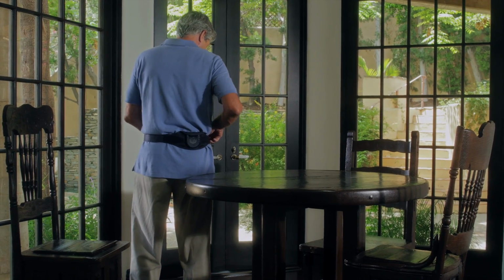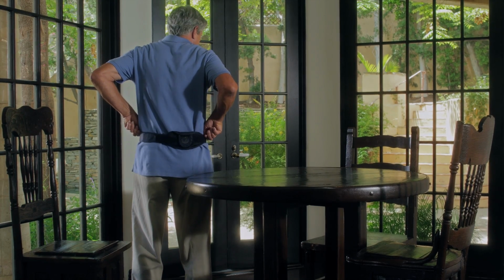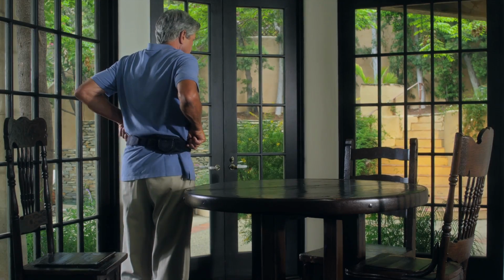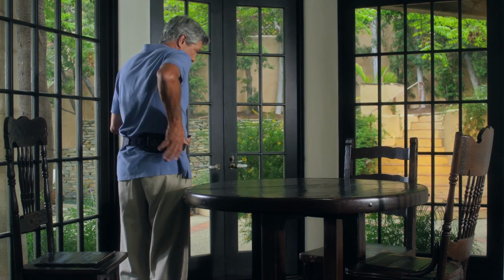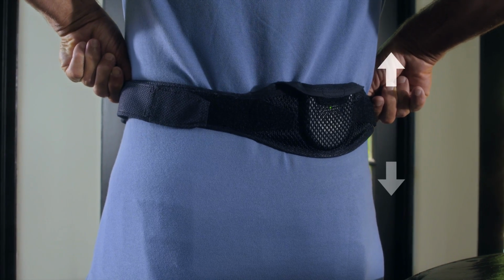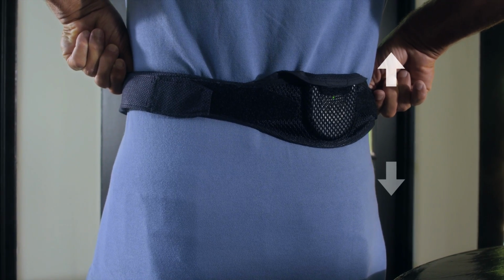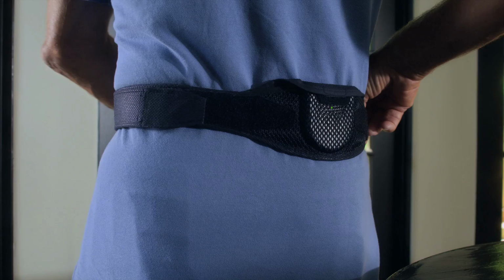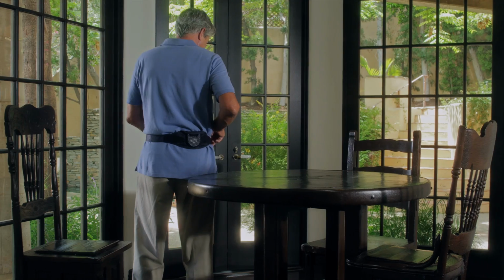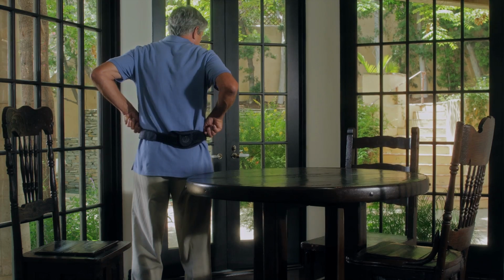For those who can't feel their stimulator, centering the charger within the area where the charger does not beep will also ensure that the charger is aligned. Here's how to do it. First, move the charger up and down from top to bottom over the stimulator. Listen for the beep to stop on each side of your stimulator. Then move the charger to the midpoint of that range.